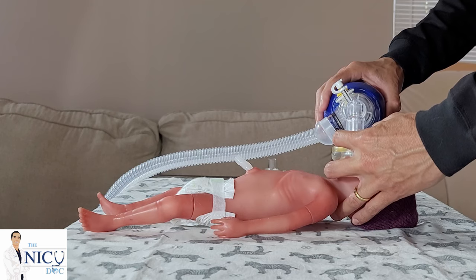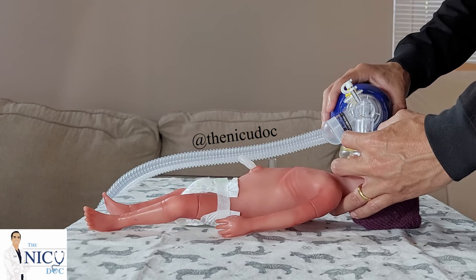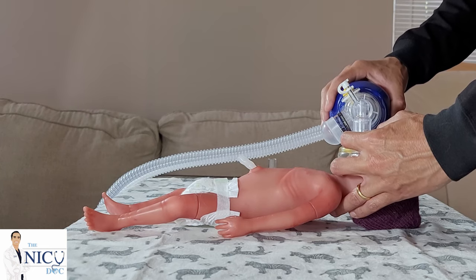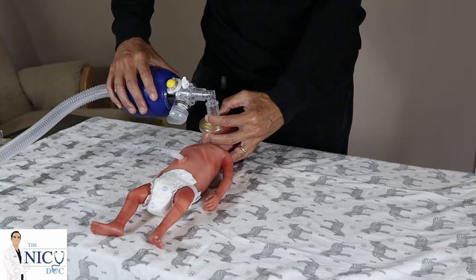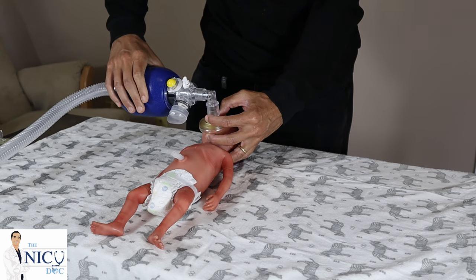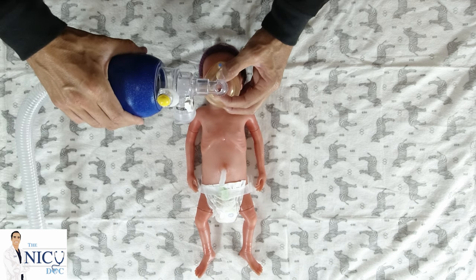Once you have this hold nicely established, you want to put slight pressure on the skin, lifting the chin up slightly using your fingers in the back for slight extension and lifting the chin with this middle finger. Be very careful with premature skin so you do not cause any trauma. Once you have a good seal, you can begin to deliver breaths. For an extremely premature baby, you want to use smaller tidal volumes where you can see the chest rise, delivering them slightly faster.